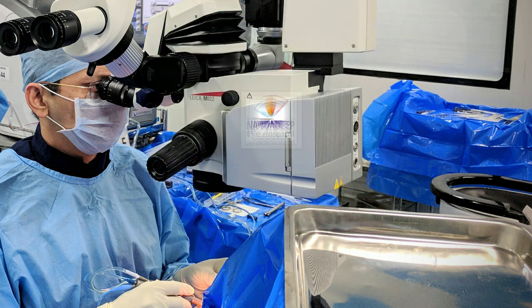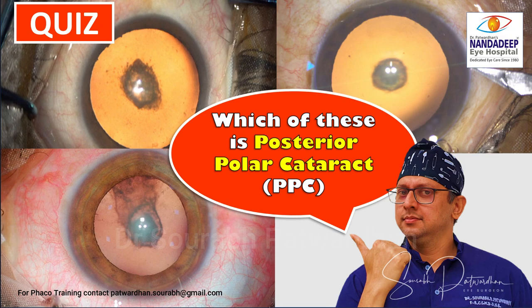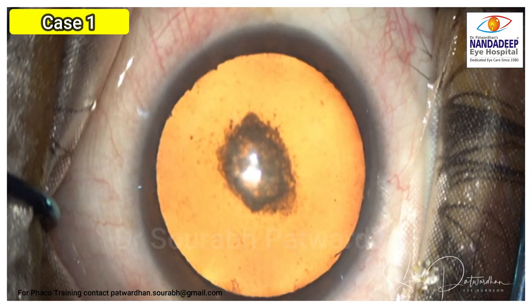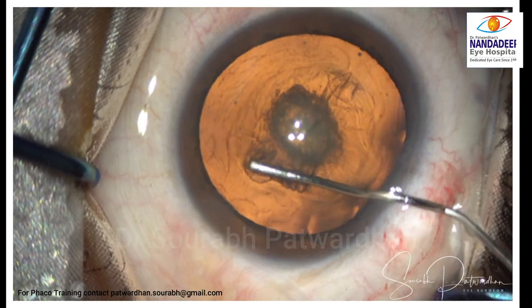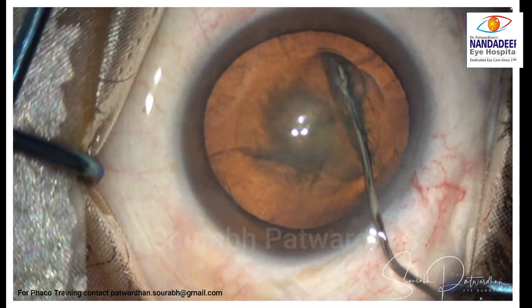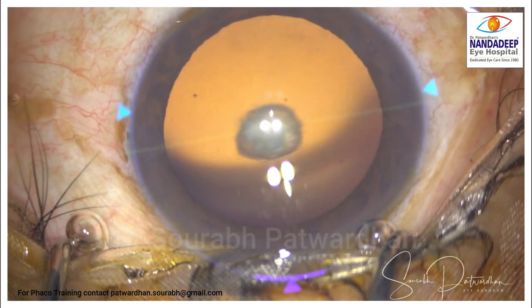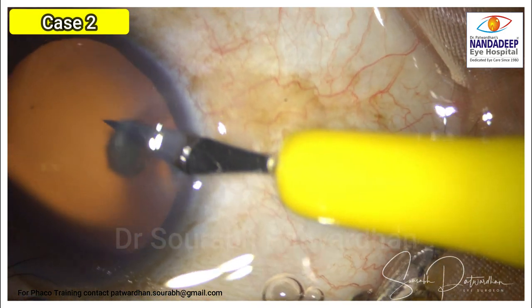In the previous video I had shown three cases of posterior subcapsular cataract or PSC and I wanted to ask you which of these you feel is a PSC and how will you go about that particular case. Case one has fuzzy margins with no well-demarcated areas in the posterior opacity, so I feel this is the posterior subcapsular cataract — a classical one — and I need not take any precautions like in posterior polar cataract.